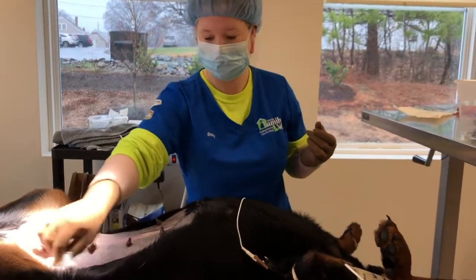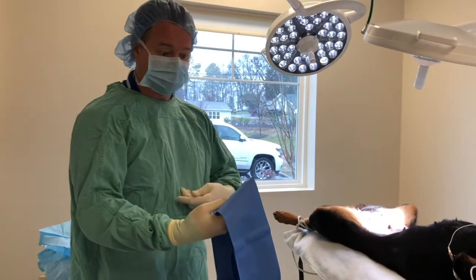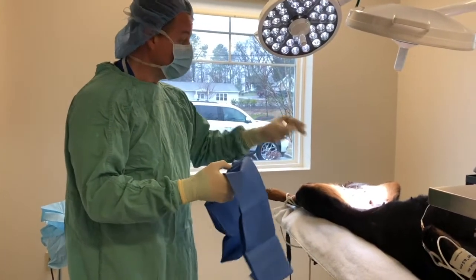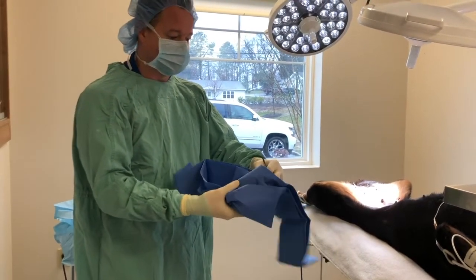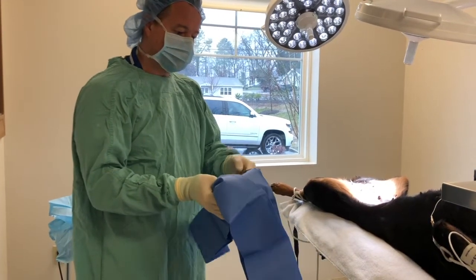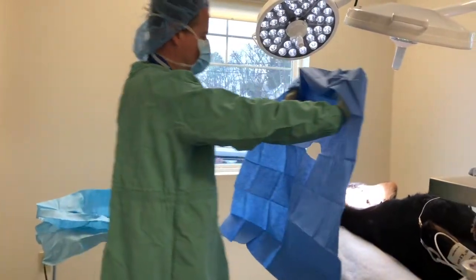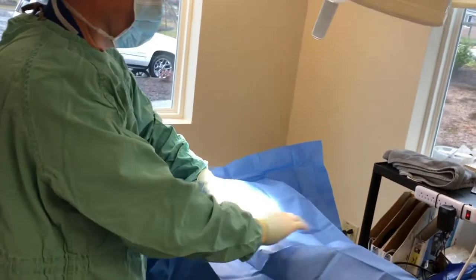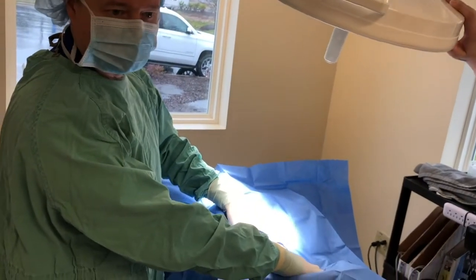This gives us the cleanest possible surgery site we can have. I'm scrubbed in, covered in — this gown is sterile, the gloves are sterile, and this drape is sterile, meaning there's no bacteria on it at all. And the dog is clean. You can never fully sterilize skin; you can only reduce the bacteria on it and get it clean. Now I've draped in and covered up most of her body, leaving just the sterile field exposed, with a limited amount of bacteria that can contaminate our surgery site.